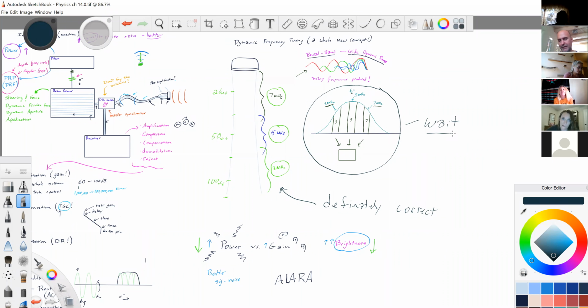I think I pulled in another concept accidentally, but this part here is definitely, and hopefully this made sense, the reason why the machine would choose 7, then 5, then 3, basically because of attenuation. So, okay, let me stop recording here.